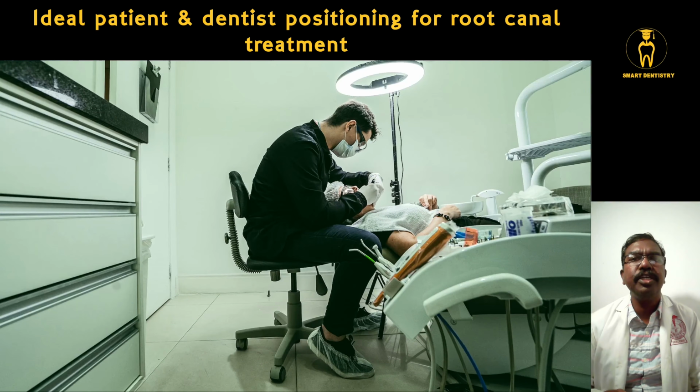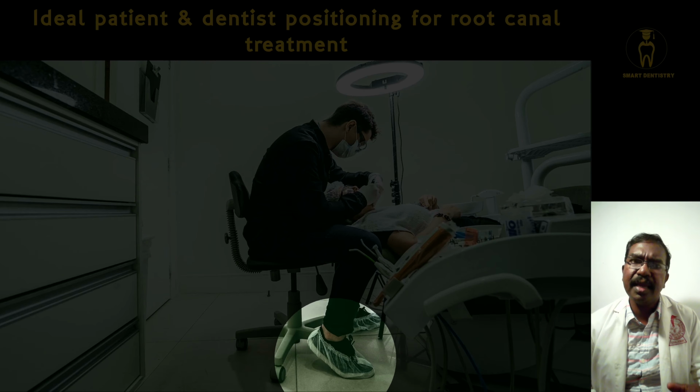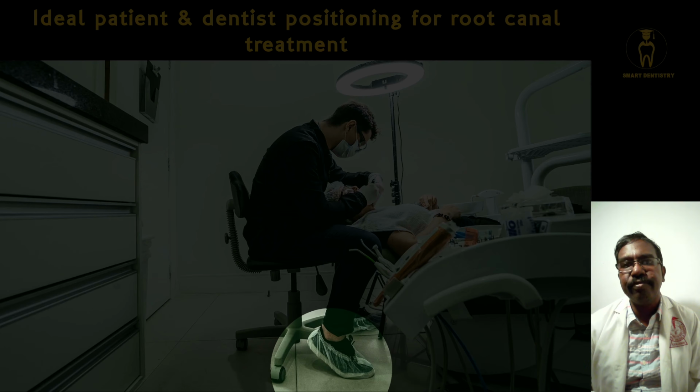The next important point that I would recommend is that the foot of the dentist should be placed properly, and there should not be any lifting or hanging of the foot from the dental stool. That has to be avoided, and the foot should be flat and kept properly on the floor.